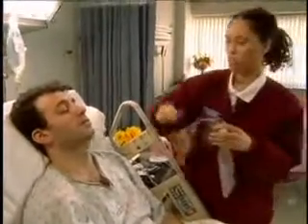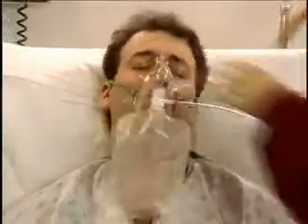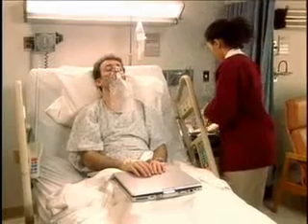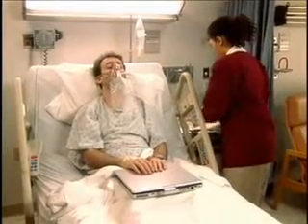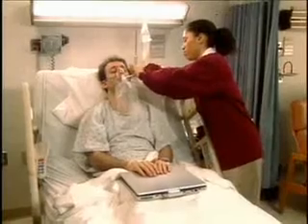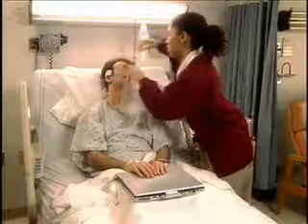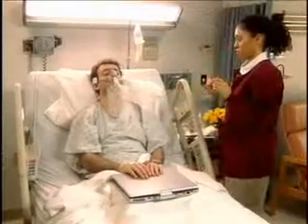And just put this on. And it's here to protect your ears. Can you look at me? How's that feel? All right?